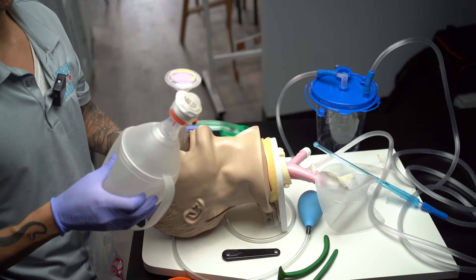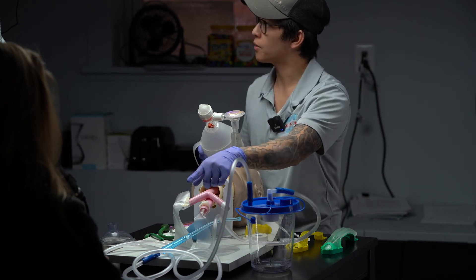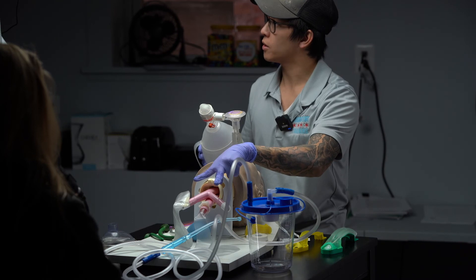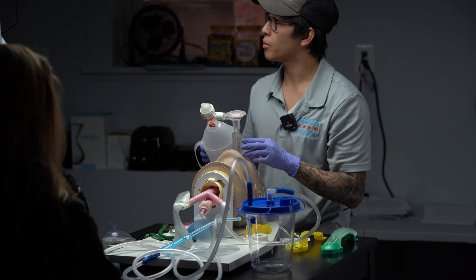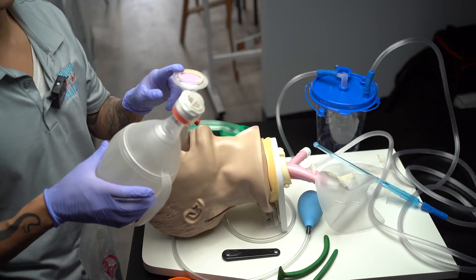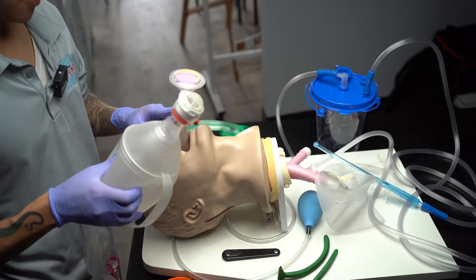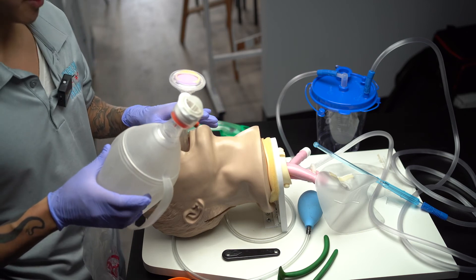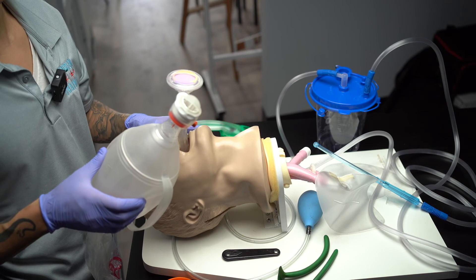Now I'm going to confirm if the i-gel is in the right spot and working appropriately. While I'm ventilating, can my partner listen for epigastric sounds? You don't have any epigastric sounds. What about bilateral lung sounds? Lung sounds heard bilaterally. Do I have the presence of condensation in the tube? Yes. What is the color of my colorimetric device? It's starting to turn gold — turning gold, good. Is my pulse ox improving? Yes. Is my skin color returning to normal? Yes.